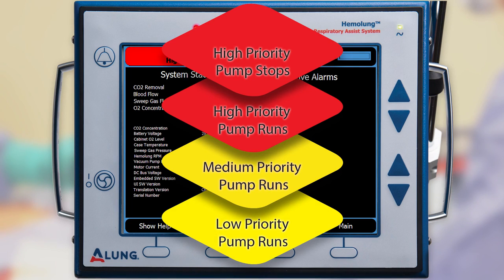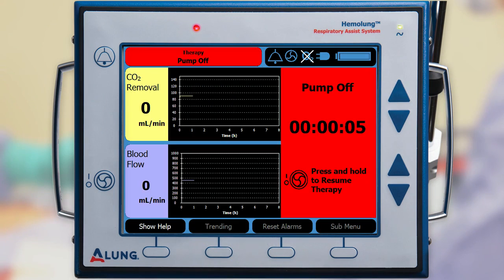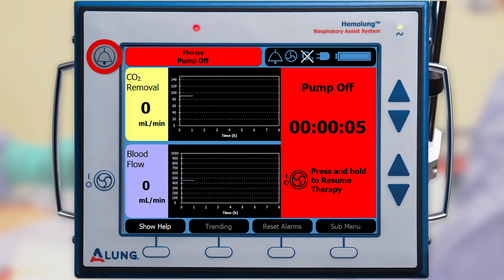Medium priority alarms notify you of unexpected system operation; a prompt response is required to prevent diminished system performance, and the pump will continue to run. Low priority alarms also notify you of unexpected system operation and can be caused by a component failure; the pump will continue to run. Audible alarms can be paused or turned off using the audible alarm button. Pressing it once will pause the alarm for two minutes; holding the button down will turn off the alarm indefinitely. Pressing the button again or the occurrence of a new alarm will reactivate the audible alarm.